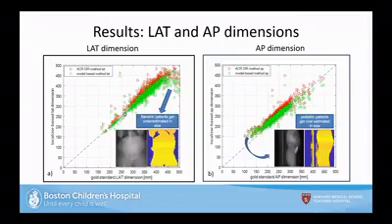Right. You have to pick: either you put in your mAs that you've determined are good on average, or you can use their thing, but they don't really work at the same time. And as I mentioned, some of these AEC algorithms modulate only in the Z direction. Some of them do it in XY, so they're different. The direction I want to go in is also developing my own AEC algorithm that will use this information. That's a long way off, but I would like to go in that direction for sure. It just makes sense to me. Do scanners have research modes where you can put stuff in? Yeah, manual modes, and we've been using that as well for continuing this project. We don't necessarily use that on patients, so we just use one of the built-in methods that they have.